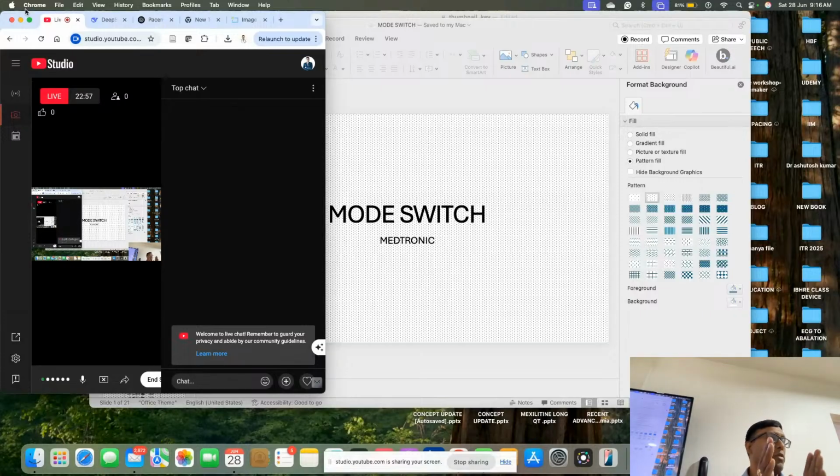So it will start counting it. Like we are counting 1, 2, 3, 4, now run. So in this, Medtronic or most of the devices have 4 beats they are going to count, which are falling in that window. So first beat, 175, second beat, 175, third beat, 175, fourth beat, maybe 150. So it will again wait for the next beat. Then it has come 175. Okay, now we should go ahead with our mode switch.